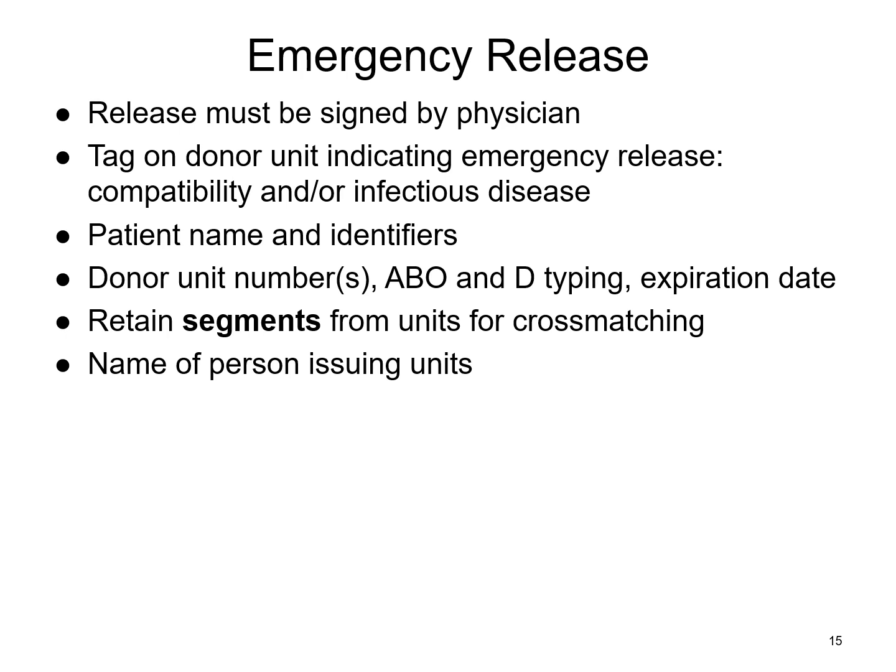But in that process, you're going to keep up with what units were issued to that patient. You're going to maintain that segment in the blood bank so that hopefully at some point you can get a sample and do the cross-matching. You're going to keep up with what products you issued, whether it's FFP, plasma, platelets, red cells, whatever it is, as well as all the information on that unit, including expiration date. And usually this is going to be in your computer system as well, but you'll have some way to document all of this.